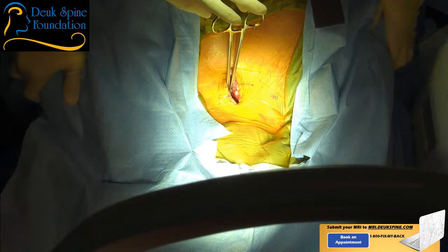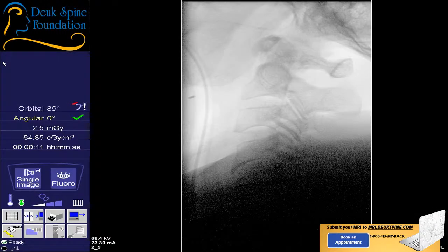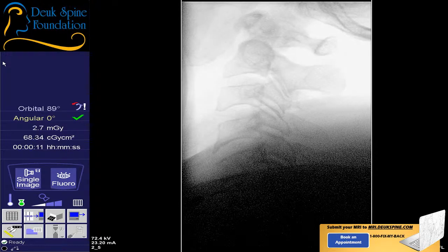All right, so 2, 3, 4. It's hard to say, but we need you to come south a little bit with the fluoro, just a little bit. And I need a better shoulder pull. Luis, you got to squeeze the shoulders down towards the feet. Take a shot. All right, good, good, good. So everyone relax. Let me get in here and look.